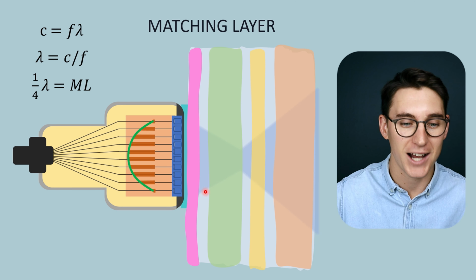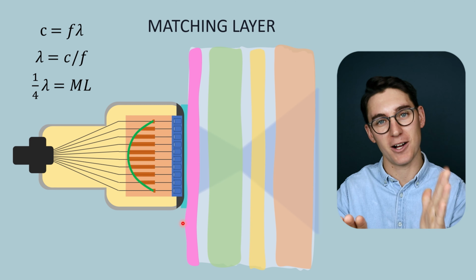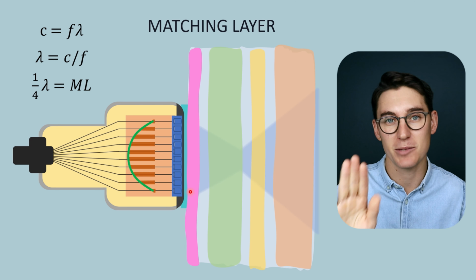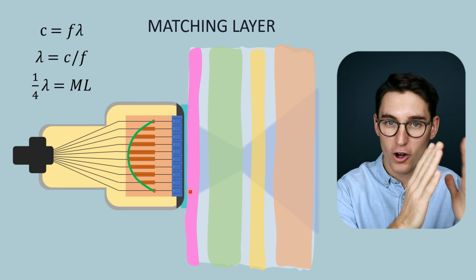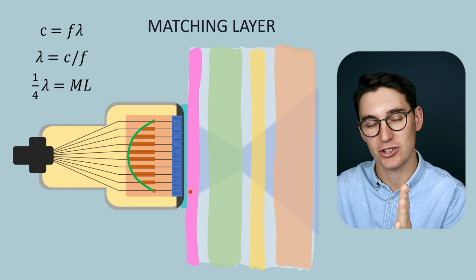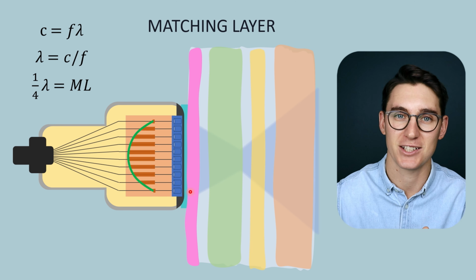And what we need is a coupling gel here. And that gel will prevent air from coming between our matching layer and our soft tissue. The acoustic impedance of that gel is very similar to that of soft tissue, and it allows for that smooth transition from our piezoelectric material through the matching layer, through that coupling gel, and into the tissue. We will have ultrasound waves now propagating into that tissue.